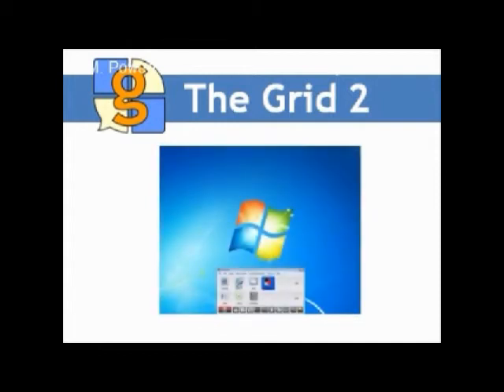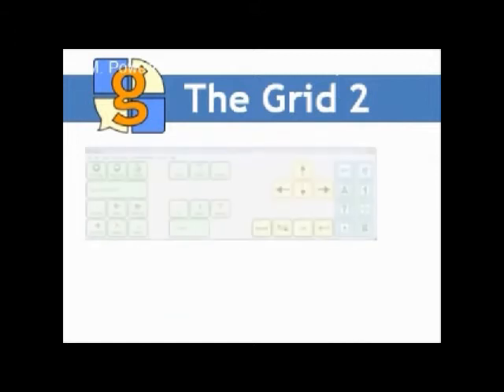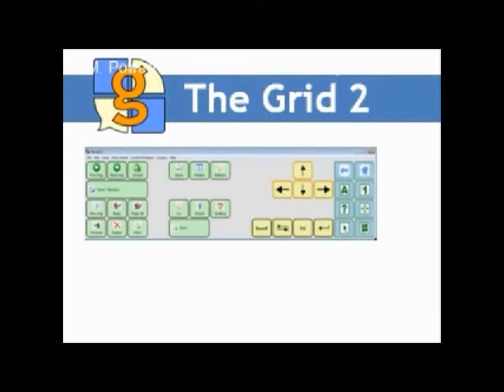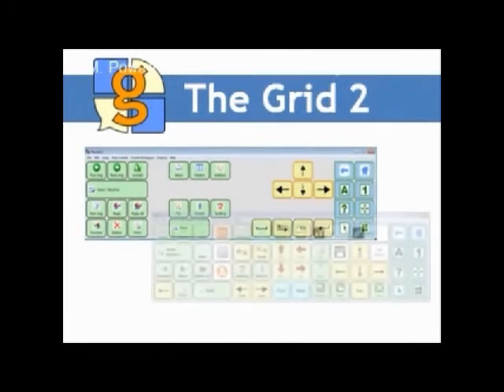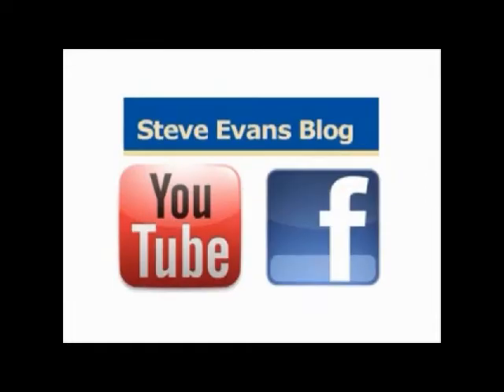I started the same modification process of the overlay grids, making hybrid grids from the standard ones and setting up automatic overlay grid switching, depending on the application being used. The framework was already there, and by learning the techniques used I could apply them to my grids. Again, fine-tuning took a couple of months to get to the layouts I use today.